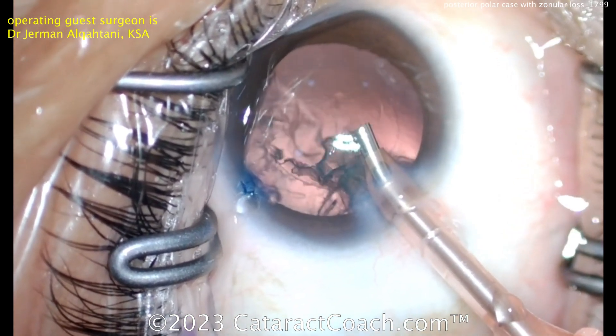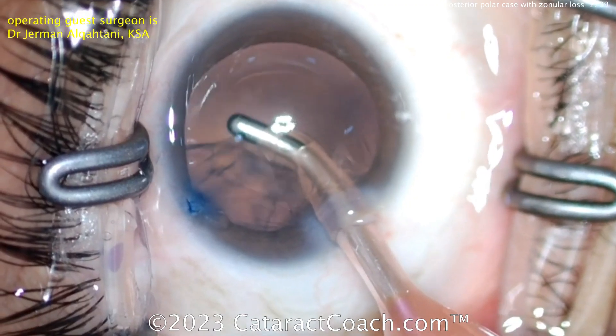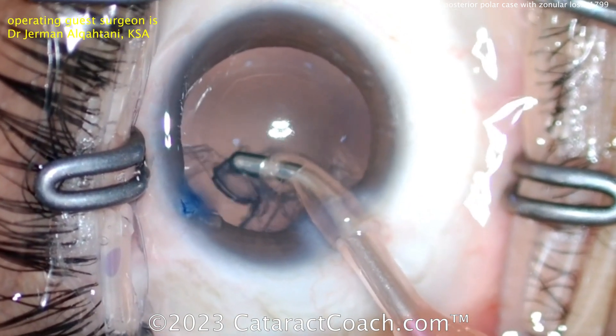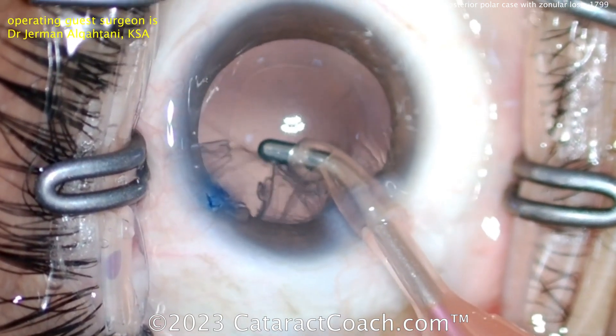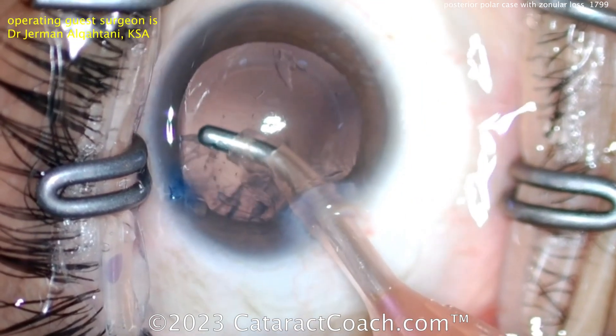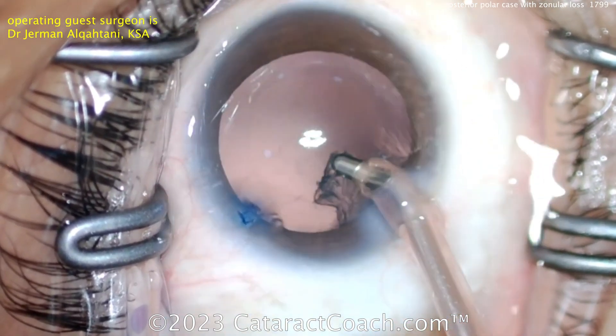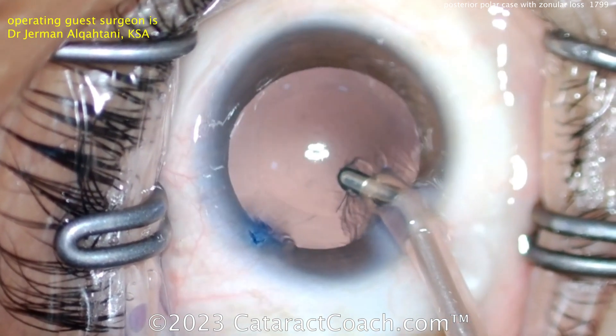You could have induced the zonular weakness as you were placing the hook or chopper to help dissect things, but so far it looks pretty reasonable. Taking out the lens cortex here — if you do see any smudgy opacity on that posterior capsule, leave it be; don't want to touch the posterior capsule in the least.